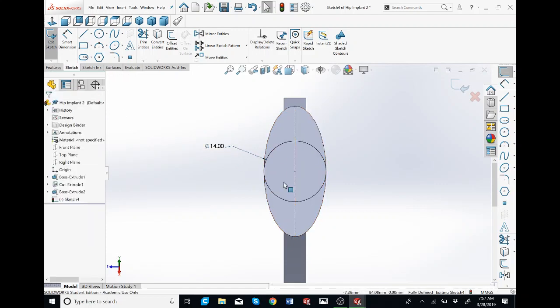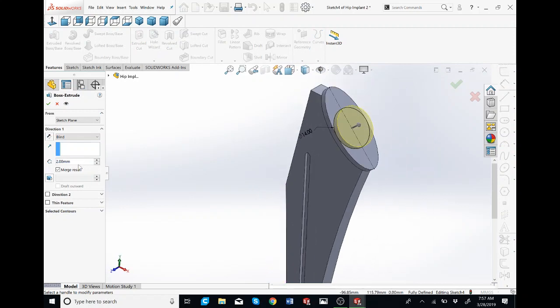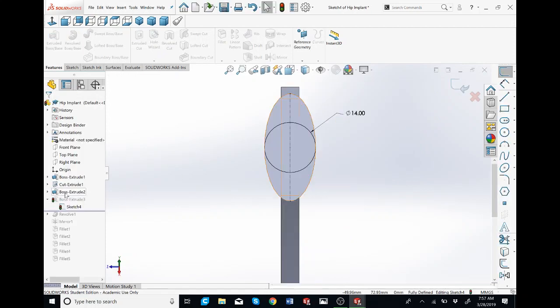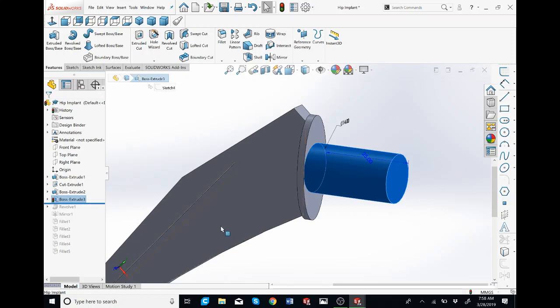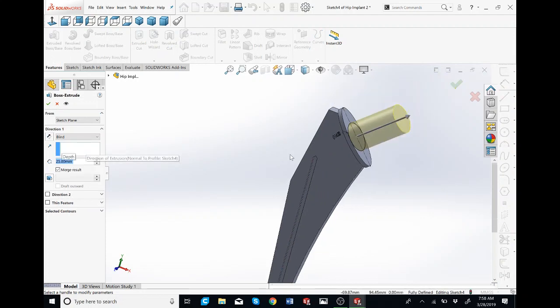You can also create a coincident relation, but that's just like dragging it and putting it onto the point because it's a lot easier. I'm going to go to the features tab, extruded boss/base. I think it was 15. Let me check. I'm just going to exit this real quick just so I know what it was. Go to this sketch. I'm just double clicking it so it highlights the whole thing. It's 25. So I'm going back to extrude, 25. Check.